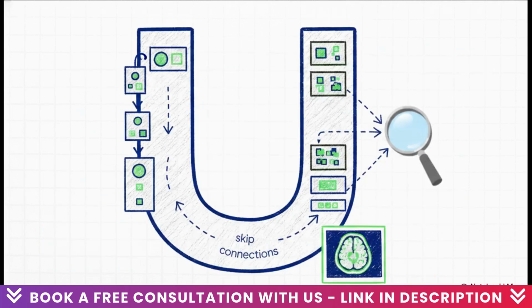Now, what's really interesting about this slide is the UNet architecture. In the world of medical image segmentation, UNet is completely king. It's famous for, well, its literal U-shaped design. As data moves down the contracting encoder path, the model captures the broad context of the whole image. Then, as it moves back up the expanding decoder path, it creates incredibly precise localizations. It also uses what are called skip connections to combine those high-level details with fine-grained pixels. The result? Absolutely pixel-perfect diagnostic masks.